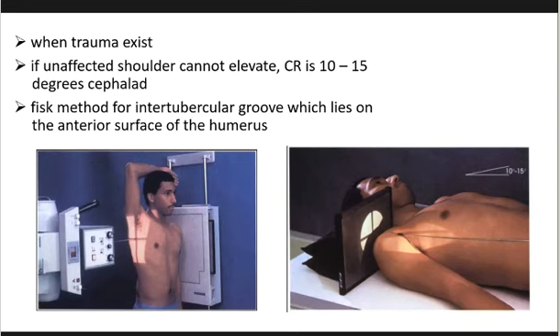The image on the right of your monitor is the Fisk method. What do we demonstrate in the Fisk method? The intertubercular groove.